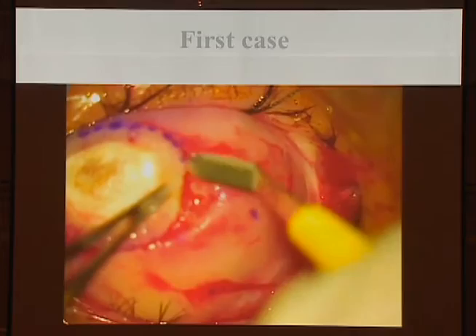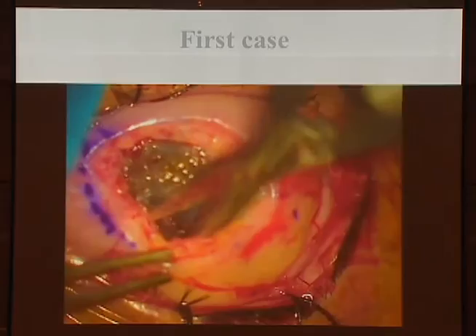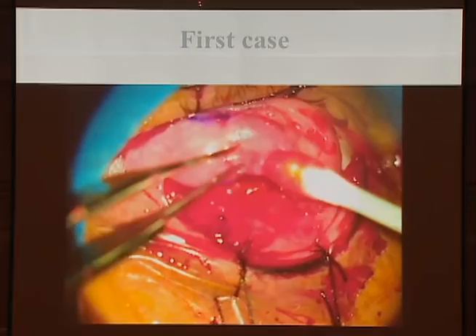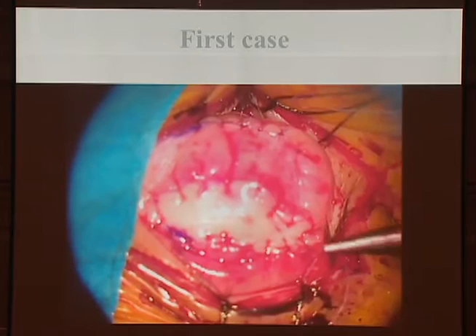And then I did a releasing incision in the superior part to create a sliding flap, or a bucco-mucosal flap, to cover the central area from the superior part of the buccal mucous membrane. After covering the central area, I harvested another part of labial mucous membrane to cover the superior part, and to have this appearance at the end.